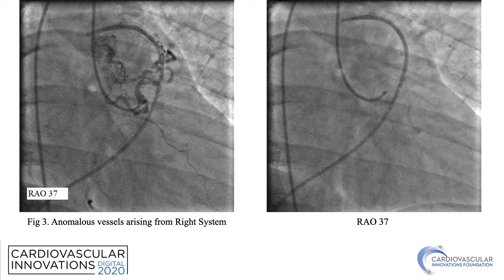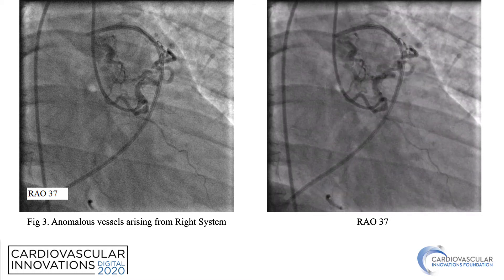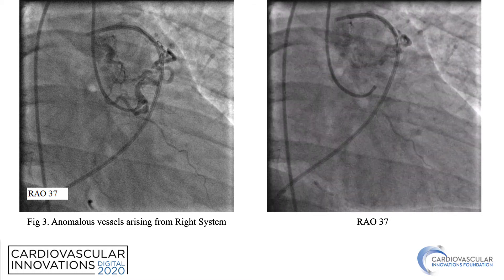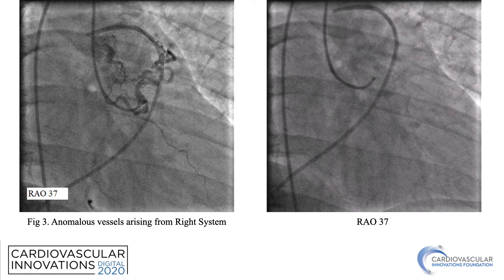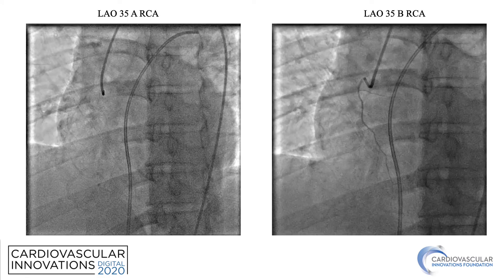This is the angiogram of the right system in which we can more clearly see anomalous vessels arising from the right system, and we can delineate a more anterior as well as a more posterior network. This is just another view of the right system and in this one you can see the anterior and posterior ring.